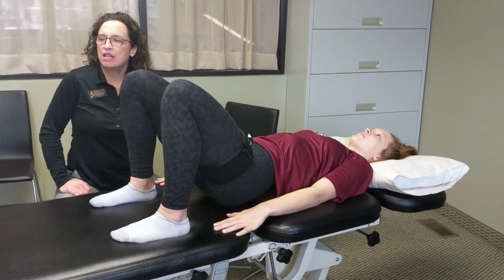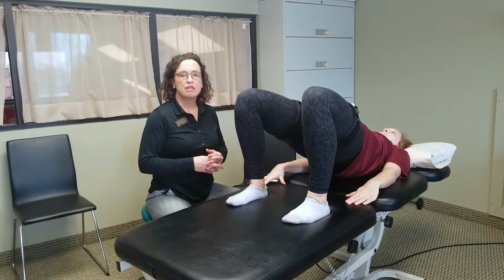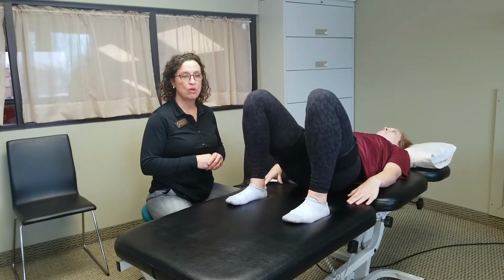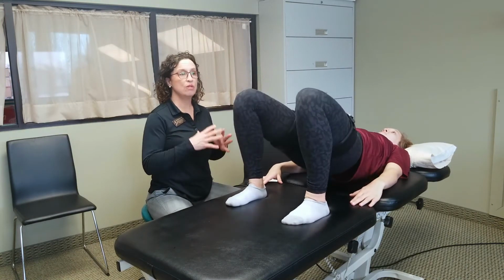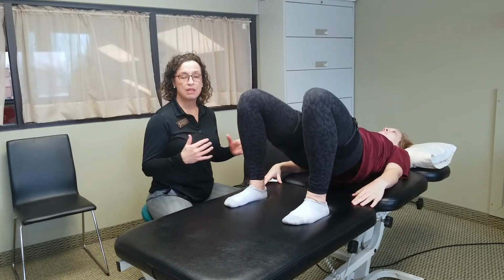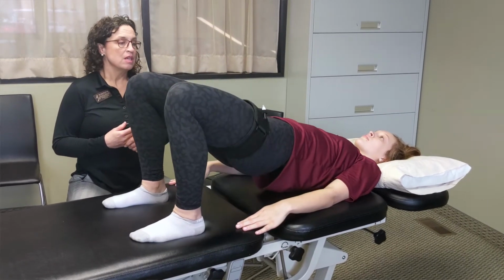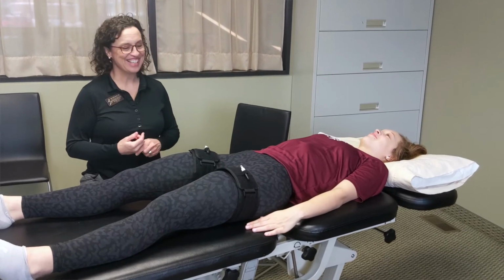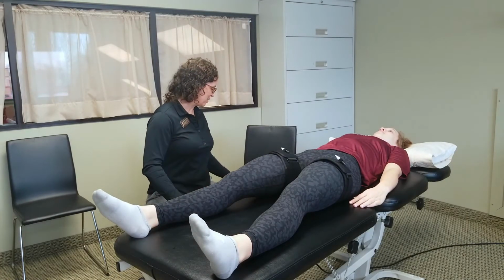The other thing we see is that in the cross-sectional area that we have incredible increases in the speed with which people get adaptations. So in a high intensity platform, we usually see that there are adaptations in the muscle that really are becoming very evident in cross-sectional area and other ways at about 12 weeks. And with blood flow restriction, you can see that happen in as little as 3 weeks time. So low intensity exercise, great, Rachel. How hard is it getting? It's a little hard. A little hard? All right. You just have one more set. You think you can do it? Mm-hmm. Okay, we'll give it a go. One more set of 15 in about 20 seconds here.